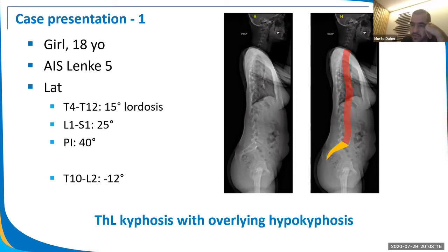Actually, with this X-ray, you have to consider that the thoracic spine is pathologic. So sure, it can be compensating, but it's not normal. So I agree.